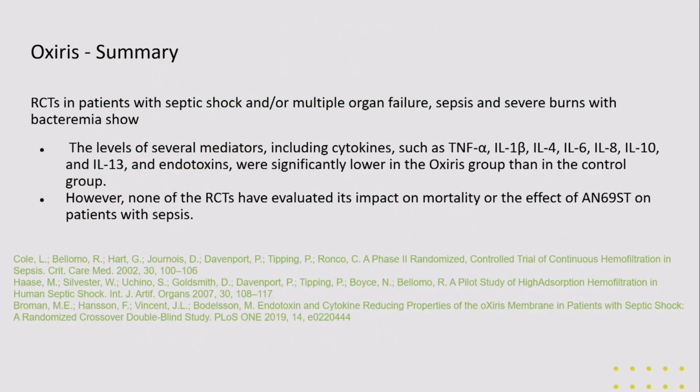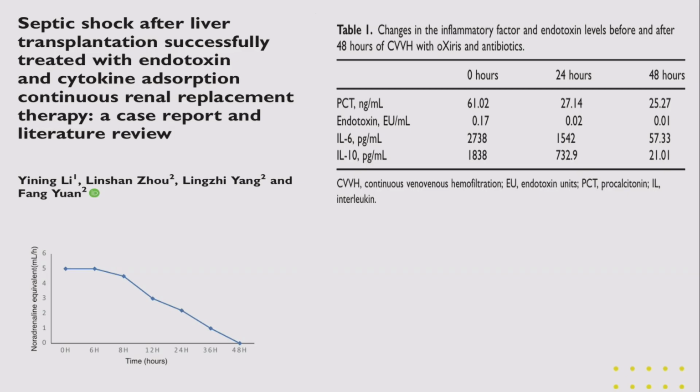So if you summarize the oXiris, it removes the drivers of sepsis, but we need more RCTs to prove it in all conditions. Can we use it in liver? Yes. In liver transplant patients, when you are using oXiris, it will not only remove the uremic toxins and the mediators of sepsis, it was seen to remove some hepatotoxins also.